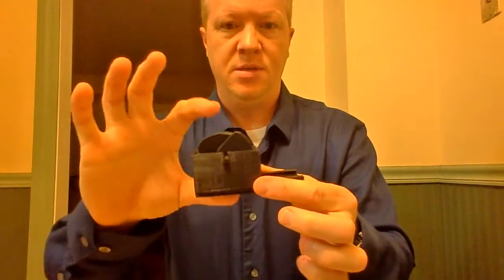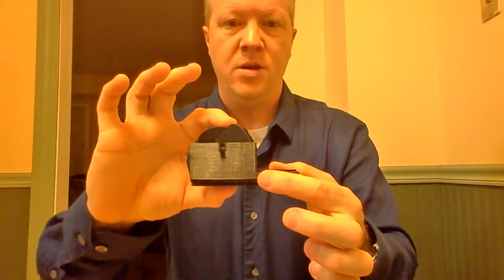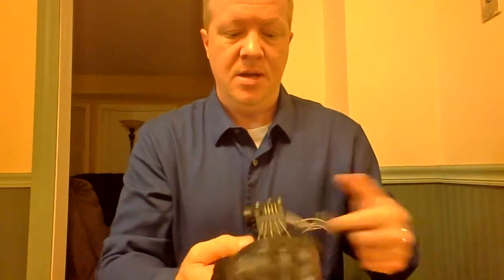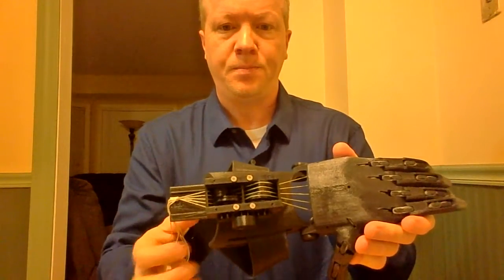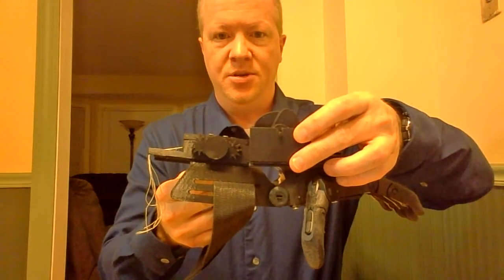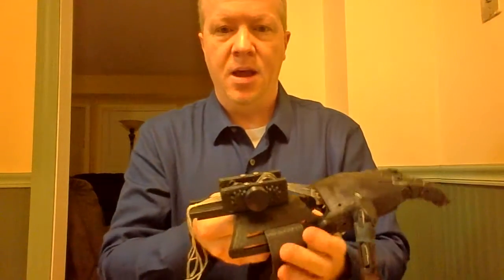But obviously this is really tall. This is like almost 2.5 inches tall. So I wanted to do something different. So I have come up with another version, and that's this. It is just about half as tall, as you can see. And it accomplishes the same thing.